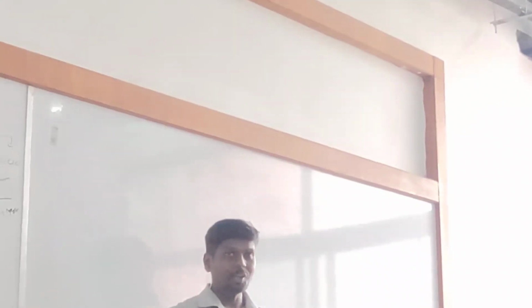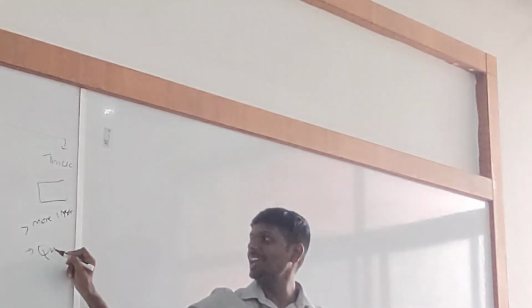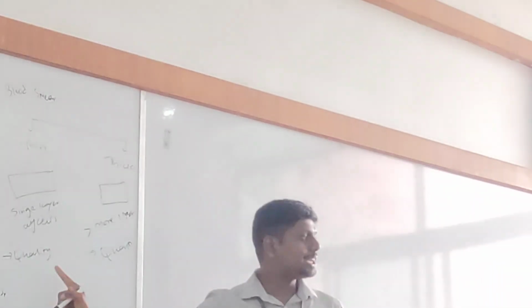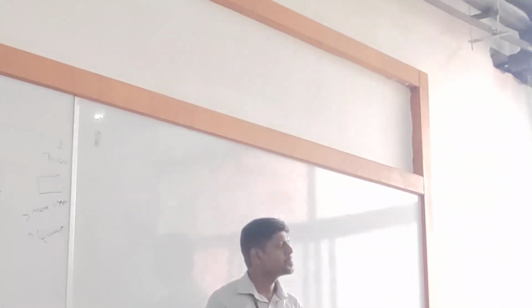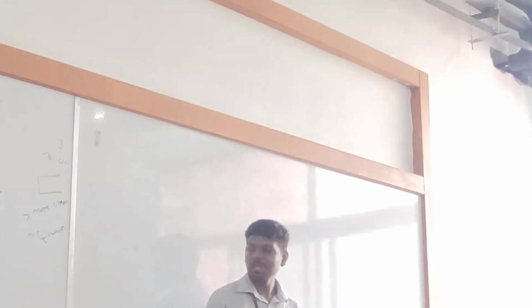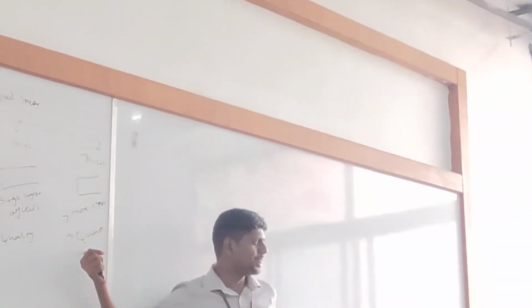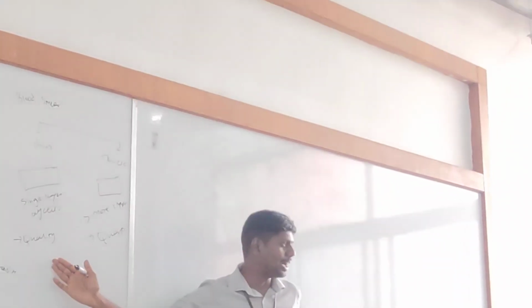Abhishek is giving more technical terms. He said thick is quantitative, and here he said qualitative. Please define in your own way. What do you mean by qualitative? In this particular case, you can check the morphology and size more efficiently compared to the other case. You are trying to say that. He might have a point. That's why he went with qualitative.